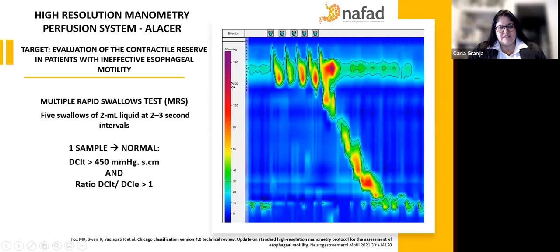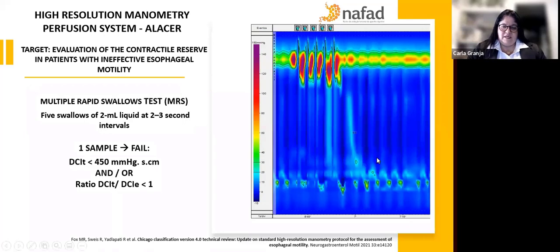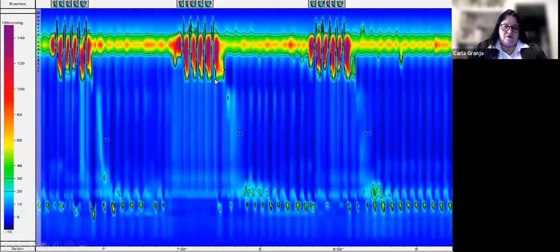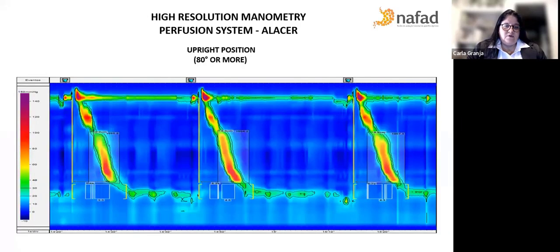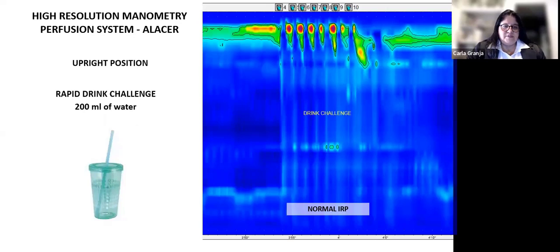This is the image of a positive test when we just do one sample. And when we have this image with a failed test, we realize a minimum of three samples of the test to do a report that there is an absence of contractile reserve. Then we repeat all the phases in the upright position, the deep inspirations, the rest pressure. And this is the image of the upright position, the wet swallows. And then we finally perform the rapid drink challenge with 200 ml of water. This is the image of a normal IRP.